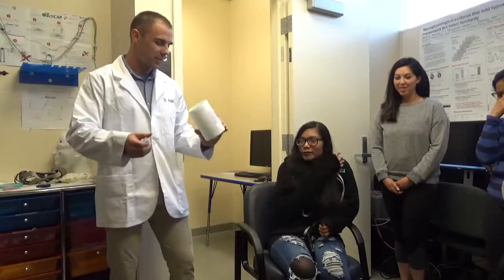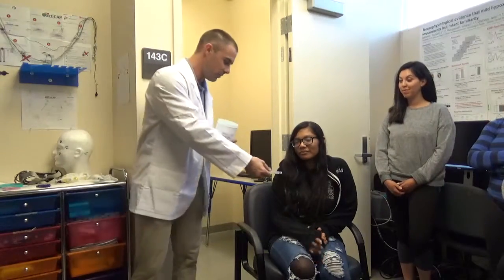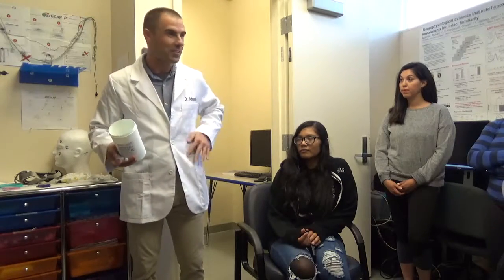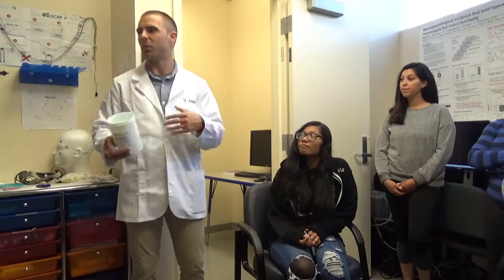Okay, so it's kind of goopy gel, and it's kind of fun. You can tell her, hey, you can feel the gel if you want to. It's a little cold, a little goopy, a little slimy, and this is a good reason why, because it gets on your hands a little bit, and then it'll dry. It'll be kind of white and flaky. So if it gets on your clothes, I was wearing a black jacket earlier, you'll get white flaky gel on it. So that's why we have these lab coats. If you need to, use a nice little napkin to clear it off so it doesn't damage your clothes. And by the way, it's not going to damage it.